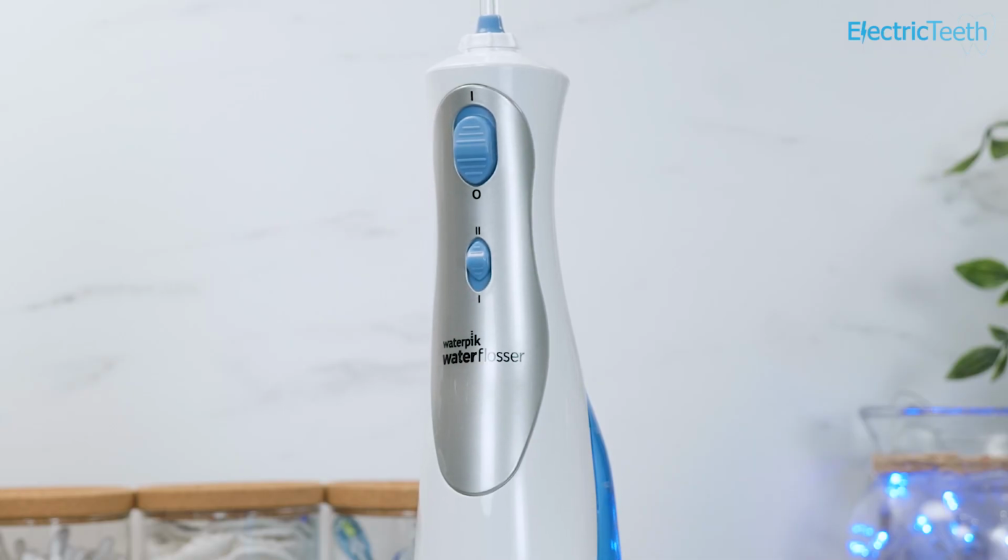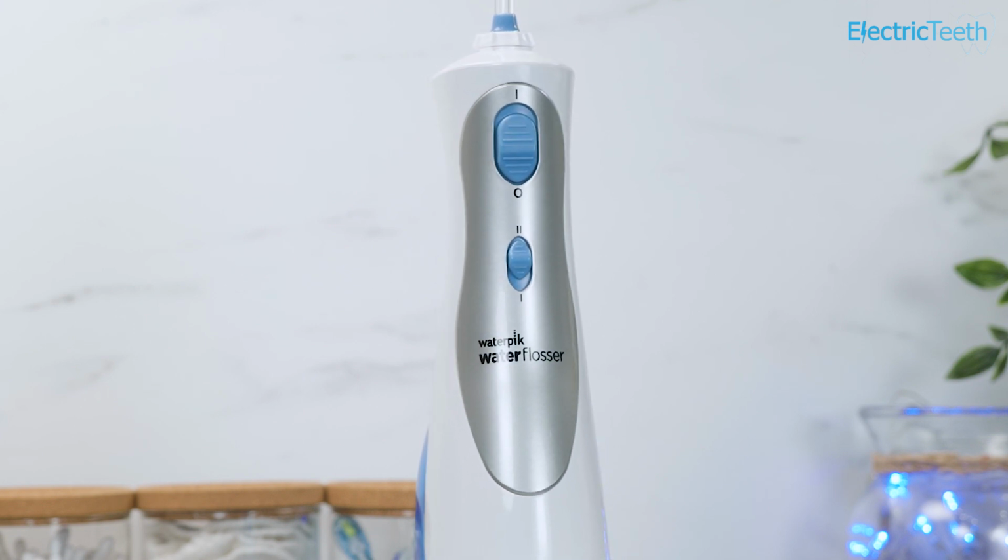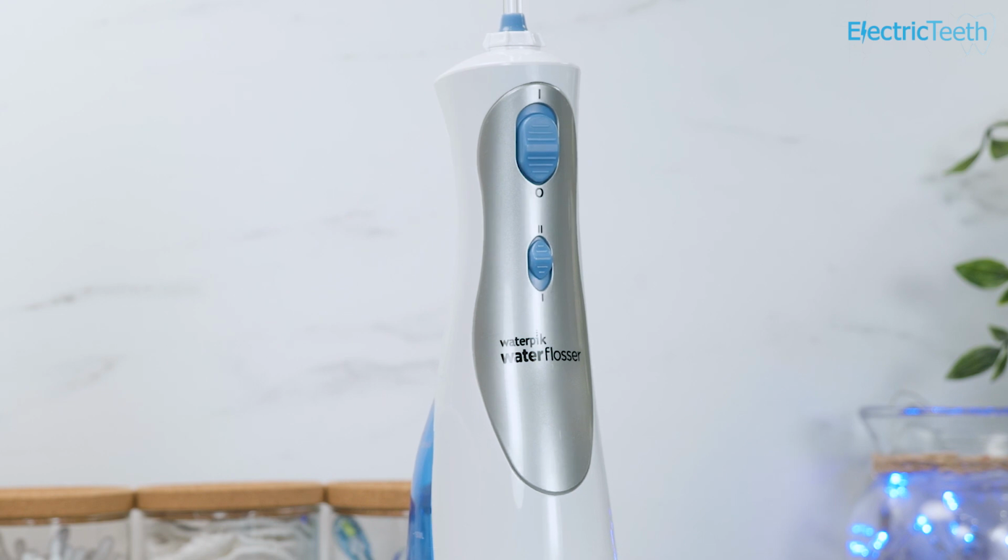You have to try and keep a rough idea in your head of when you last charged this, or just keep topping it up periodically to make sure that you're not in the position where you're using this and it runs out of power. On a modern appliance like this, it's really disappointing to not have some form of indicator. It's built into some of the most basic pieces of technology today, so it's a real shame in that regard.